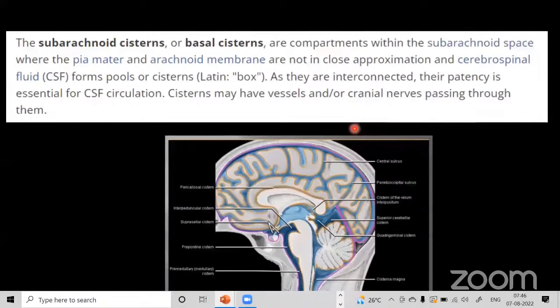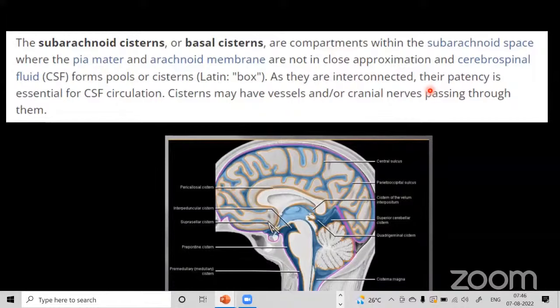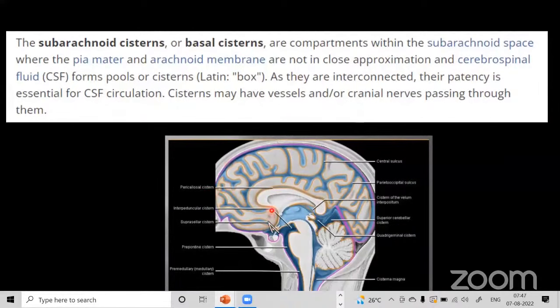The subarachnoid cisterns or basal cisterns are compartments within the subarachnoid space where the pia mater and arachnoid membrane are not in close apposition, and CSF pools in these areas. Because they are interconnected, their patency is essential for CSF circulation — blockage anywhere may hamper normal CSF flow. These spaces normally contain CSF, vessels, and cranial nerves.